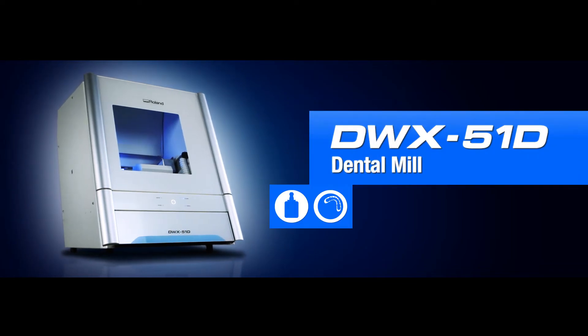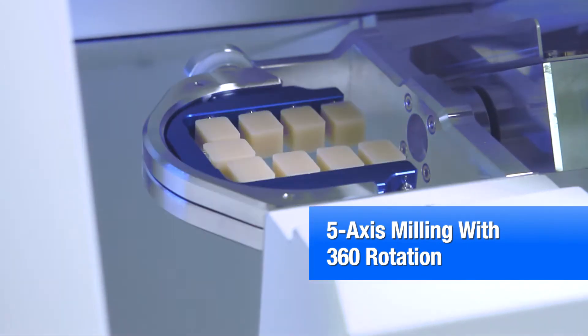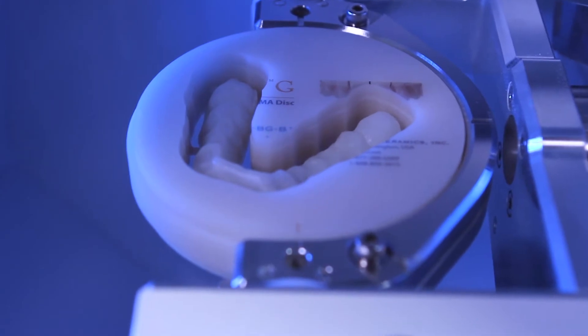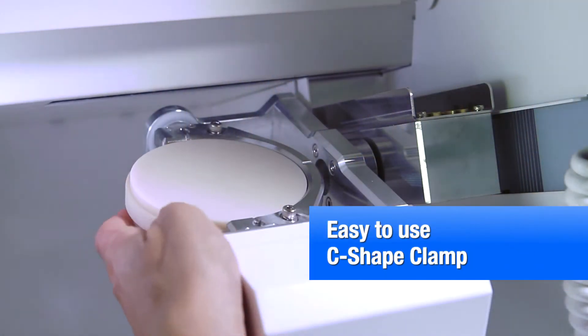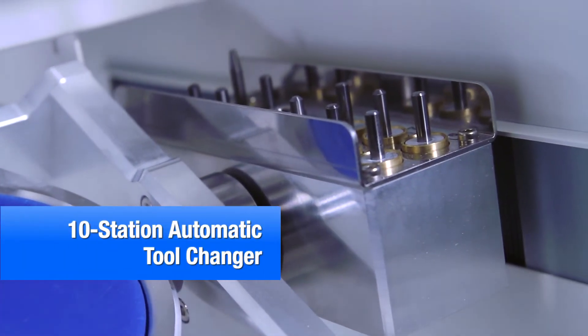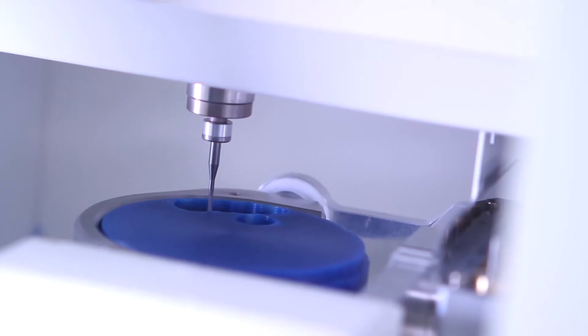The DWX51D has been completely redesigned for your business, delivering effortless precision milling of popular restoration materials with the highest quality results. User-friendly operation and a host of advanced features allow for efficient, clean and profitable production.